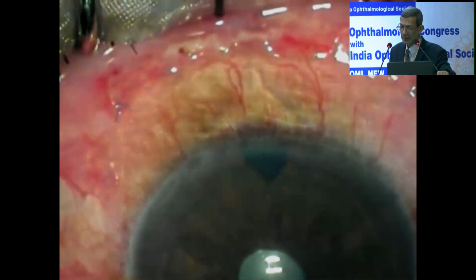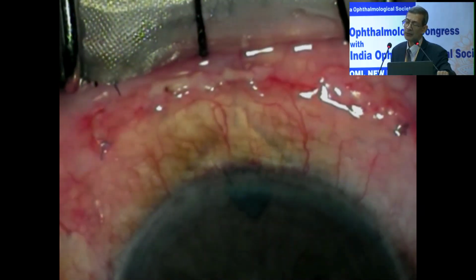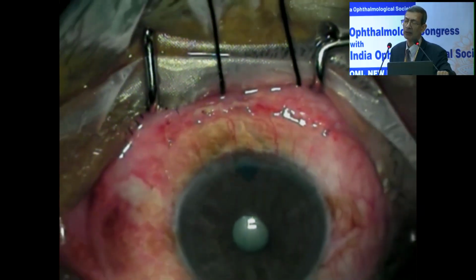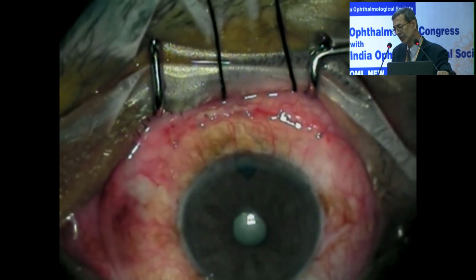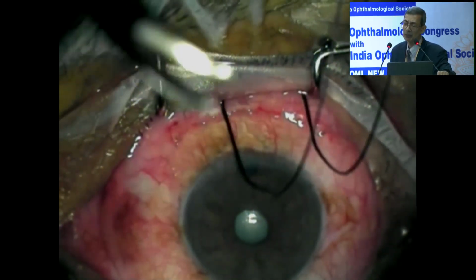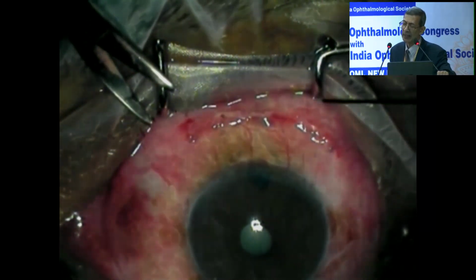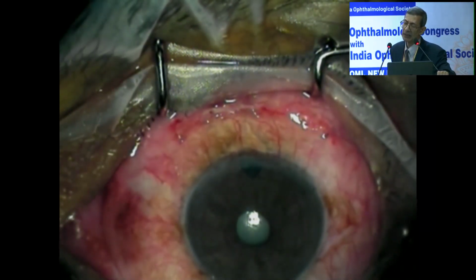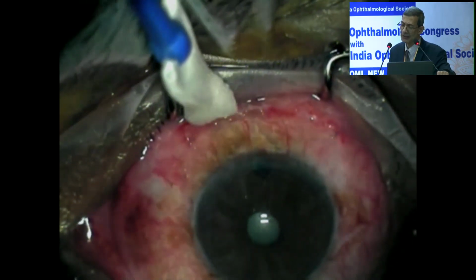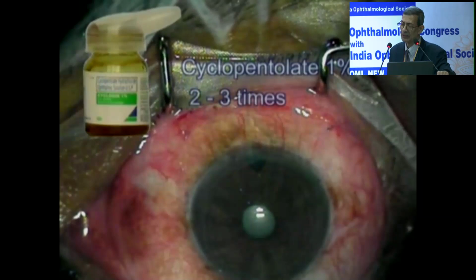Now the question is, in difficult situations, this is an isolated trabeculectomy. If I do combined trabeculotomy and trabeculectomy with cataract extraction, I do a fornix-based incision, because limbus-based causes more manipulation and more problems. This is the end of the technique. At the end of the surgery, the superior rectus suture is released, removed, and inspection is done so that we know the closure is good.